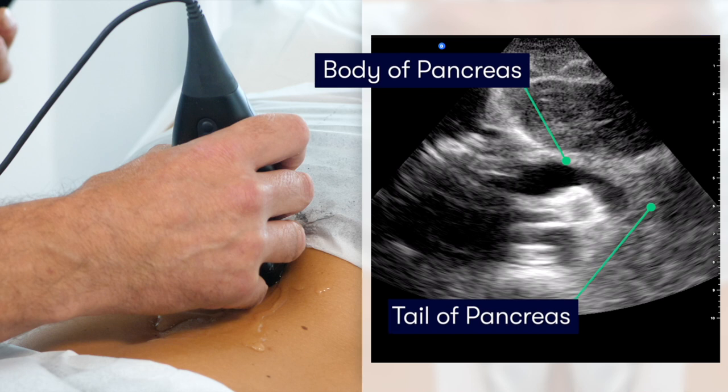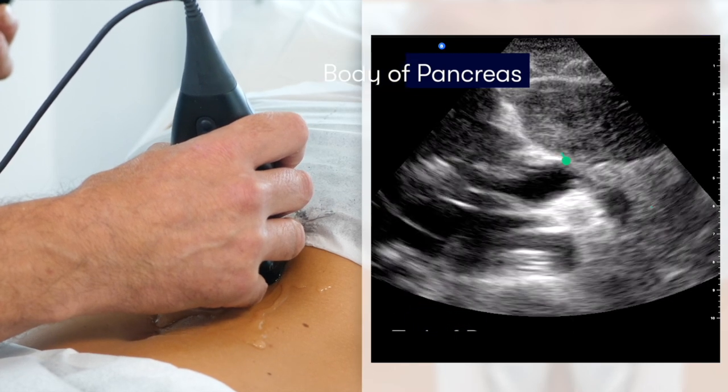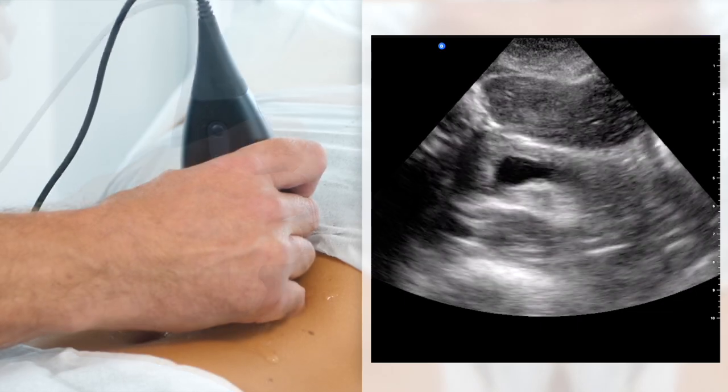So there we have the body of the pancreas located in the midline, and we can also see the tail of the pancreas, which is not always easy to identify in some patients as the stomach often obscures our view. But in this patient, we're able to see the tail of the pancreas really nicely.